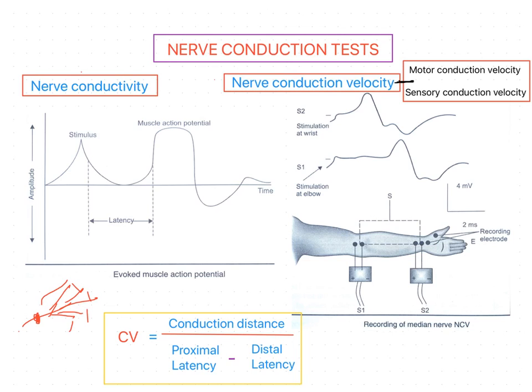Testing of nerve conduction is commonly used in conjunction with the plotting of strength duration curves, so nerve conductivity can be measured through SD curves. An impulse with a duration of 0.1 to 0.3 milliseconds is applied at a point where the nerve trunk is superficial, and any contraction of the muscle supplied below the point indicates that at least some of the nerve fibers are intact.